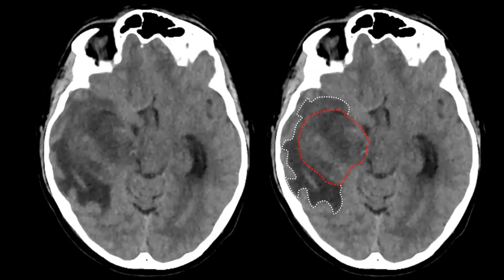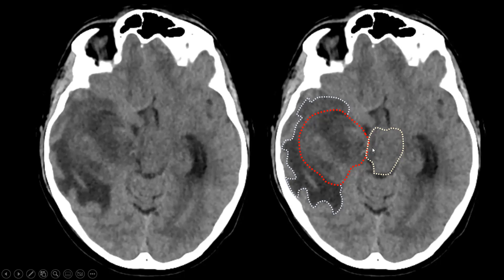In the same patient, we see the tumour surrounded by oedema. Look at the level of the basal cisterns — you should see the perimesencephalic cisterns around the mesencephalon, but here they are narrowed and sometimes completely effaced. The mesencephalon looks flattened and deformed because brain tissue is herniating from the right temporal lobe through the tentorial notch and compressing the mesencephalon — transtentorial herniation.